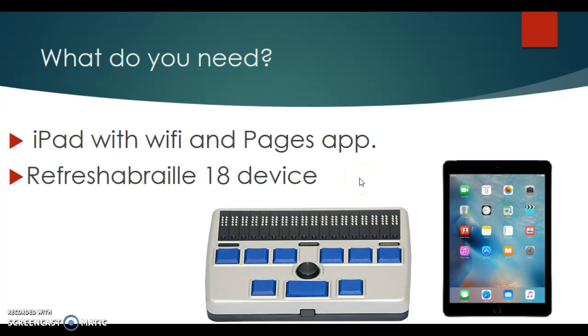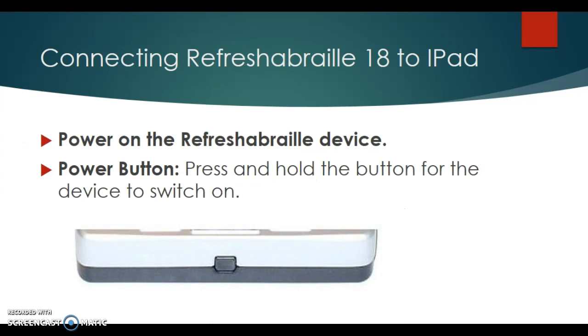So what do we need? We need the Refreshabraille device, which looks like this. We need an iPad with Wi-Fi and the Pages app. The first step is to connect these two devices. So how are we going to connect?